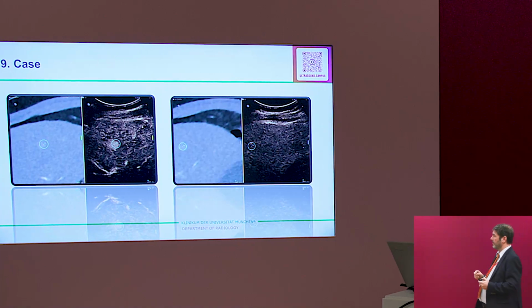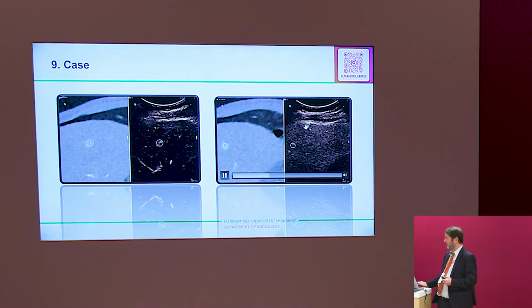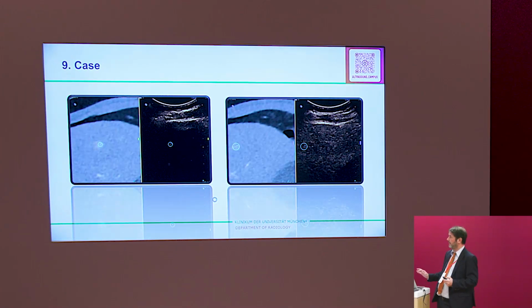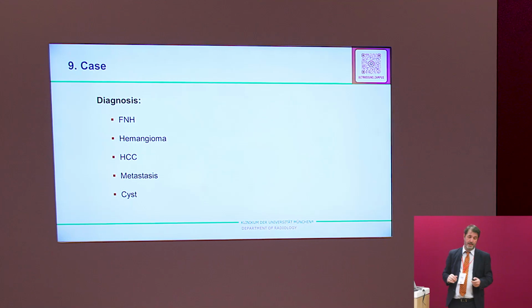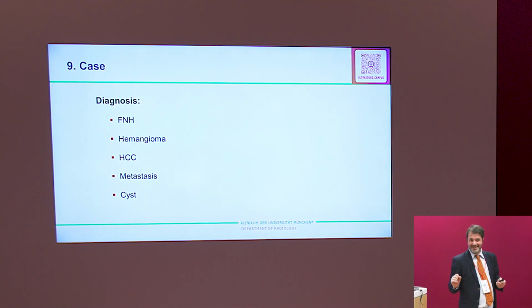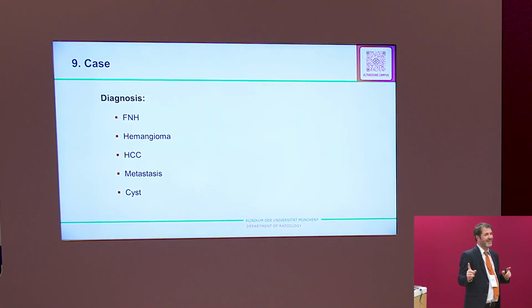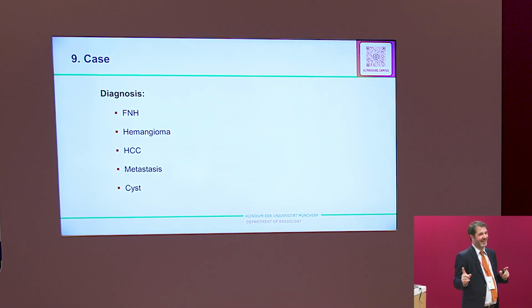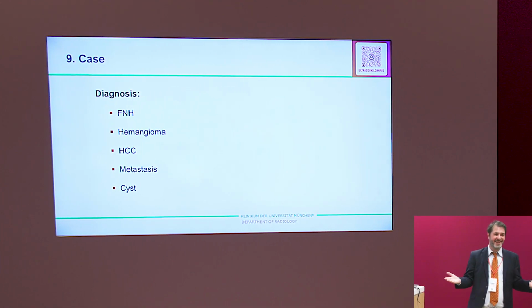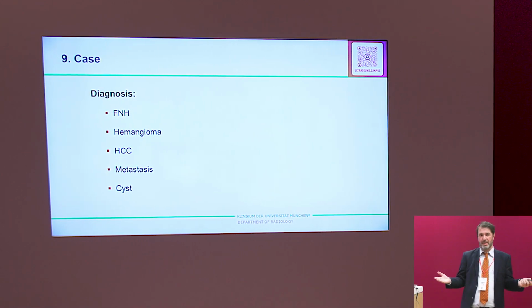And if you look later, in this area, it's getting darker. Okay. Now, a lesion which has an uptake and gets dark is what? Malignant or benign? When it changes contrast. It's a 50-50 chance. It's very easy. Changes, malignant.